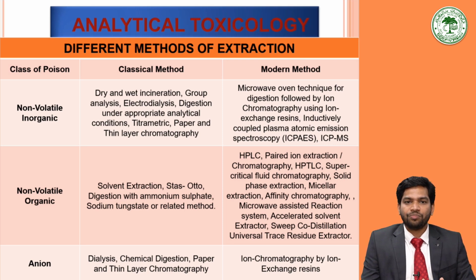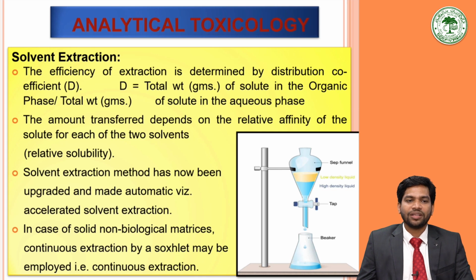So, some of them we will be talking about with the extraction methods and some of them we will be dealing with while talking about the analysis part. So, now we will understand some of the different techniques that are used for the extraction. One of the good techniques is solvent extraction.